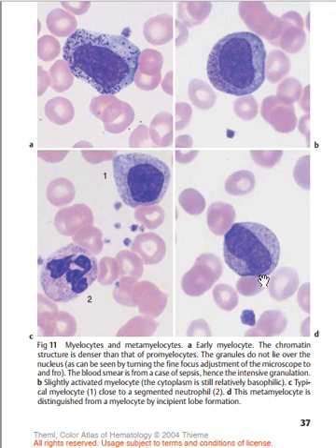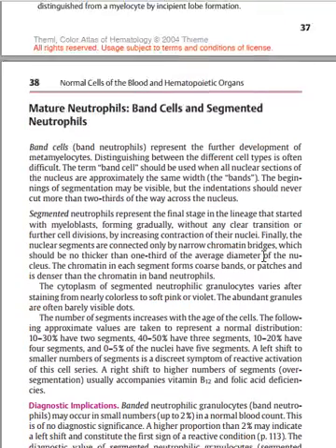And this diagram D shows a metamyelocyte, distinguished from the myelocyte by the lobe formation. So here you have a bean shape of the nucleus. Is it clear? So the first one is the promyelocyte. The promyelocyte is going to have a nucleus which is completely clear because it contains euchromatin, while in the myelocytes the nucleus is going to be a bit darkish because it is made up of more condensed chromatin. And then the last one, the metamyelocyte, is going to have a bean shaped nucleus.